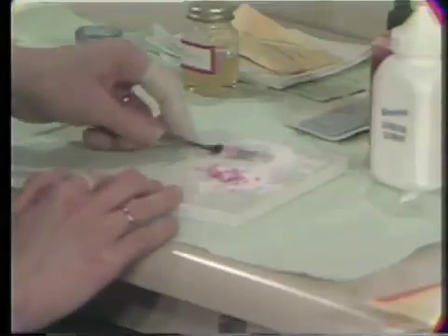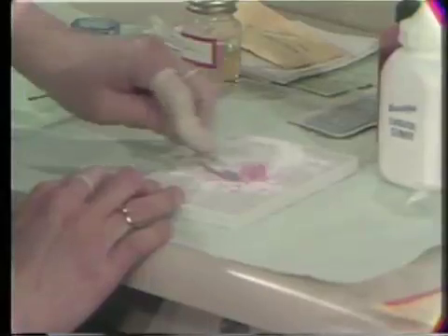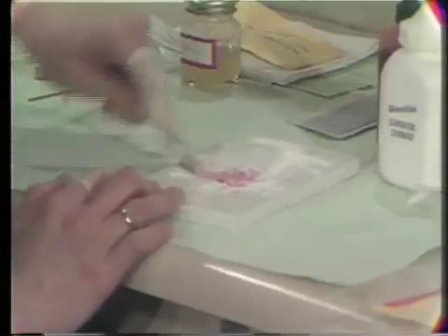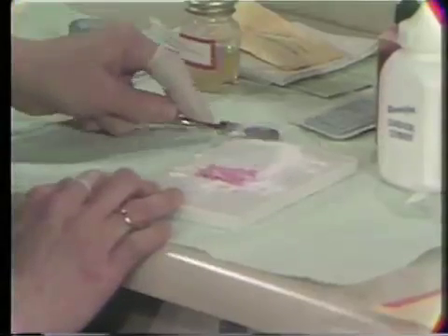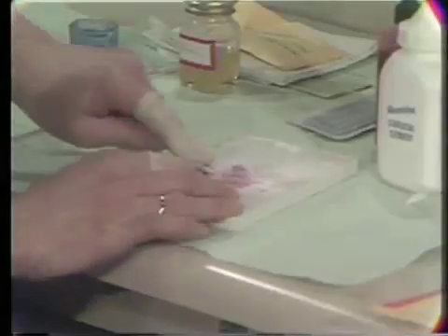During periodontal training, one of the more difficult things was to learn how to mix this dressing material. And after I once got that degree and license, I don't have to mix it anymore, and I'm thankful for that, and now the assistants have to do it. But it takes quite a little muscle to mix that well.